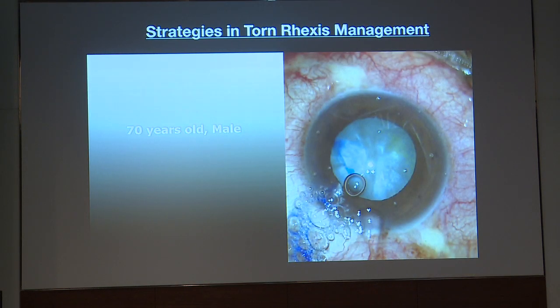So what should we do when you have an Argentinian flag sign? How do we manage such a case?